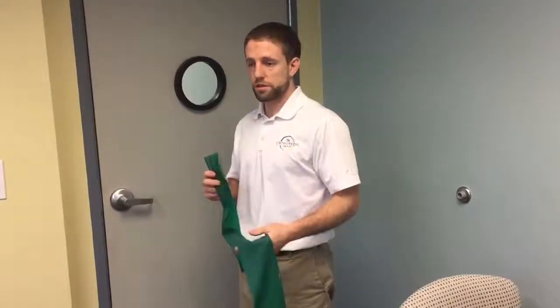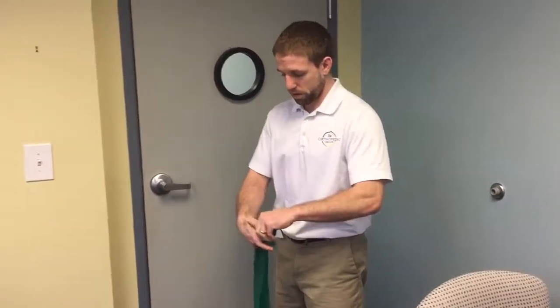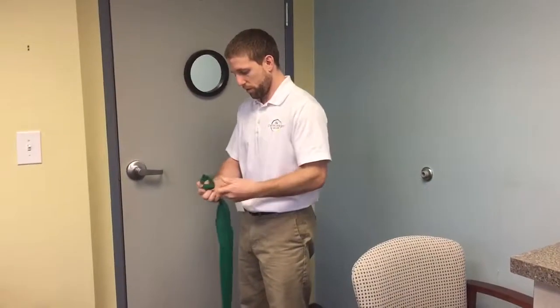I have a TheraBand here. I'm going to use this to work on some behind-the-back range of motion and strengthening into that position. I'm going to take the band and tie a couple knots on the end — this is going to allow me at home to put this over top of my door, coming out of the door.